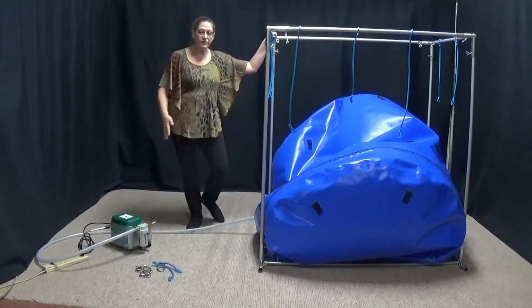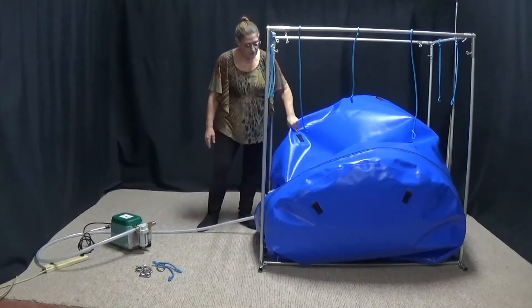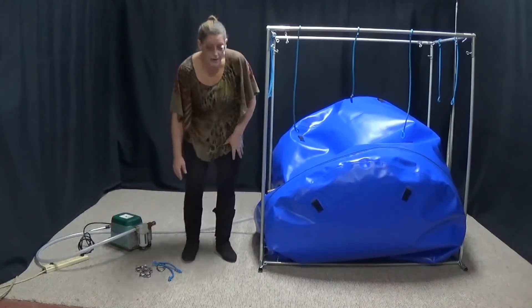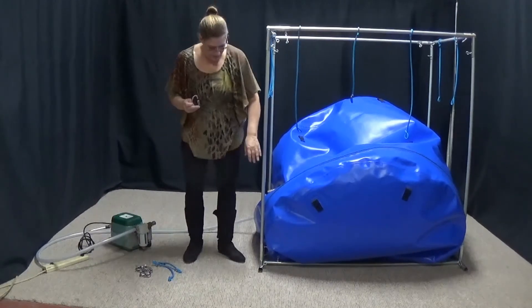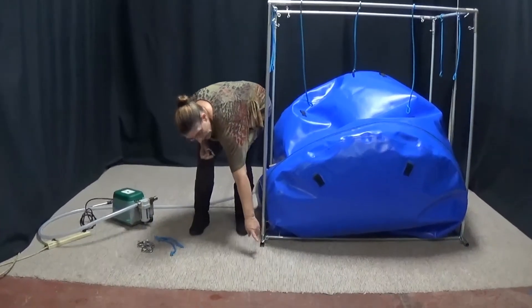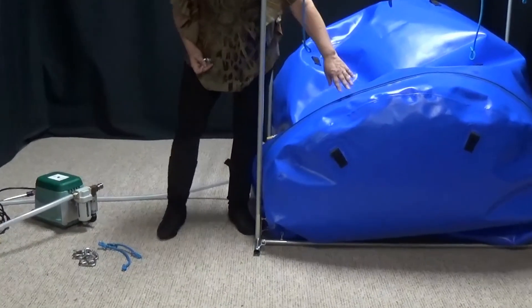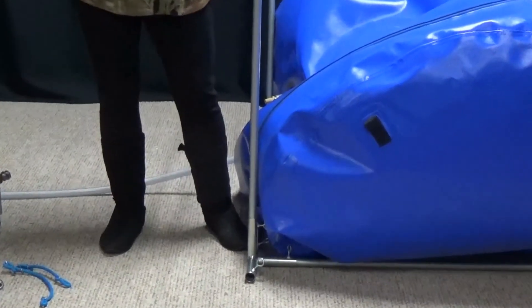I've gone ahead and turned off my compressor because I really don't want this to keep inflating while I'm doing the next step. We're going to put our Delta Quick Links in our hangers. At this point you'll notice that the poles are sticking out that I'm not using, and the zipper should be on the same side. If it's not, go ahead and flip your chamber so that it is sitting the way it's supposed to be.